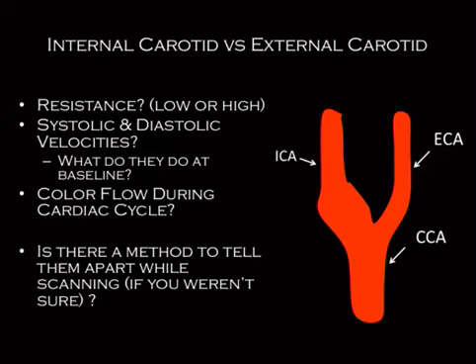Now contrast that to skeletal muscle, including those muscles in your face. They are on when they need to be on. So if you're talking and you're laughing or you're lifting weights or whatever, then the resistance waveform will change. But at baseline, you've got a high resistance waveform because you're not using them. Diastolic flow is not continuous. It will return totally to baseline. So that's the main principle.